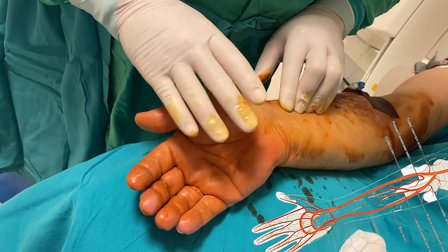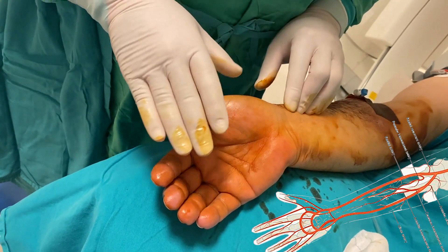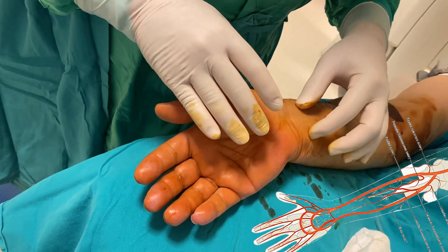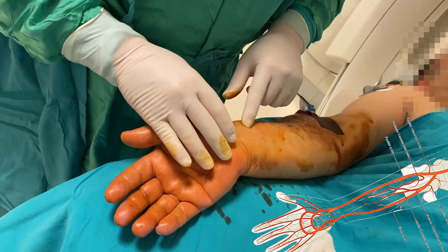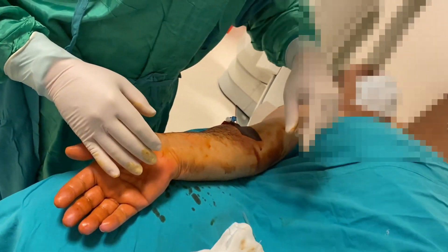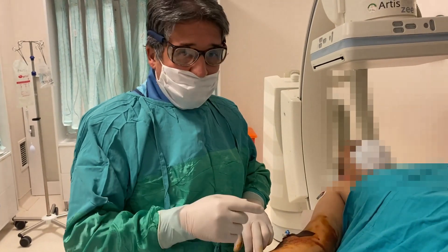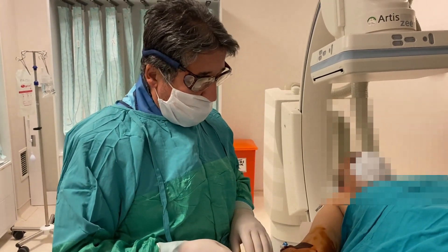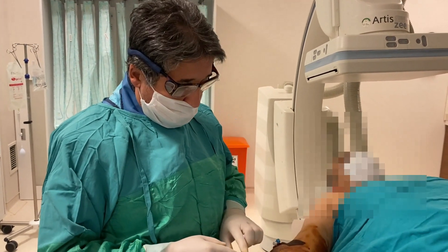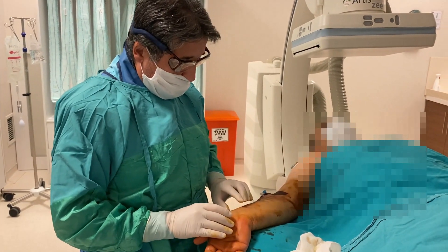Bu damarlardan bir tanesinin en azından açık kalması lazım. Biri tıkanırsa sorun değil. İkisi birden tıkanırsa avuç içi ve parmaklar zedelenebiliyor, hasar görebiliyor. Biz kalbi görmek için atar damardan, radyal arter üzerinden yol alıp kalbin ana damarlarının filmini çekiyoruz. Eğer toplar damarı kullanırsak kalbin sağ tarafına gidiyoruz; kalbin atar damarlarını göremiyoruz. Onun için atar damar üzerinden gidip kalp damarlarını görüyoruz.